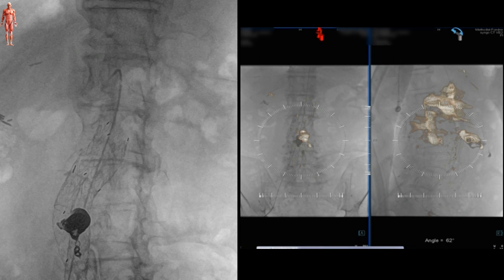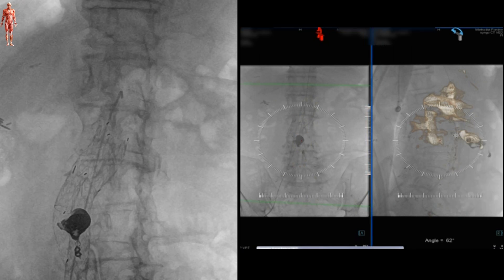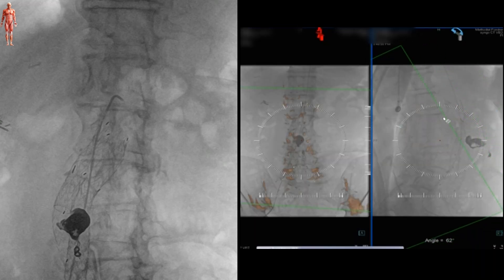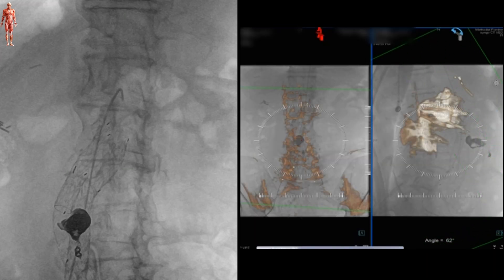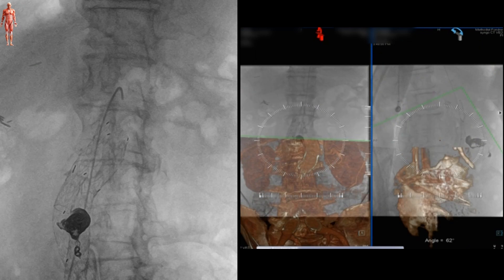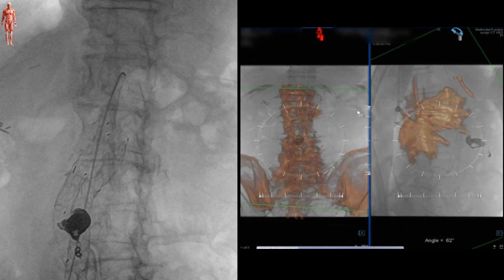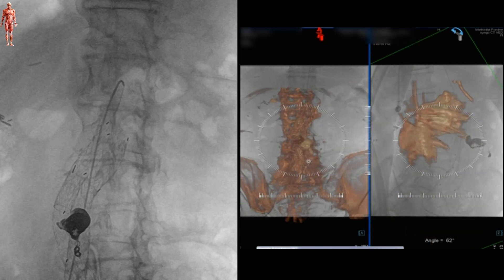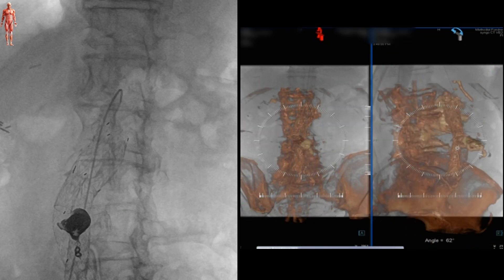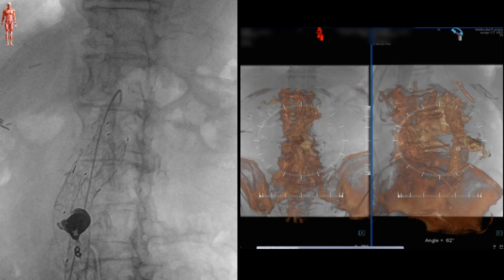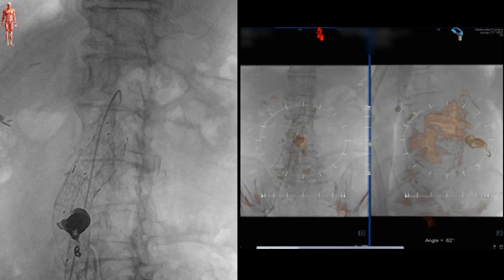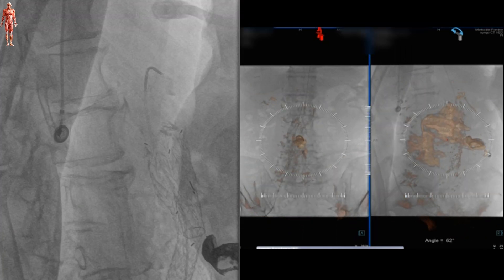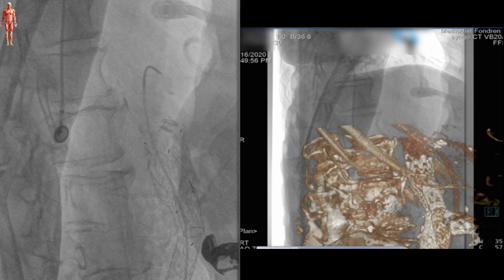The implanted stent graft, vessel wall calcification, or the previously used embolization material can also be used to enhance precision. After the registration is complete, we can mark the origin of the target vessels — in our case the SMA — with a circle to facilitate cannulation.